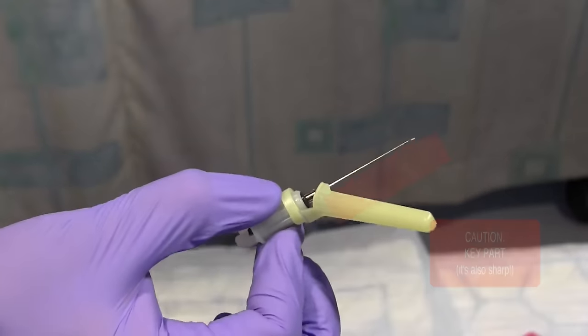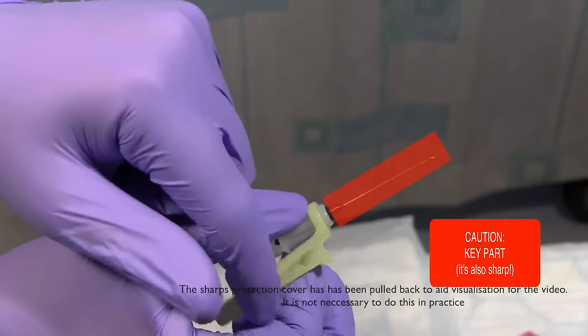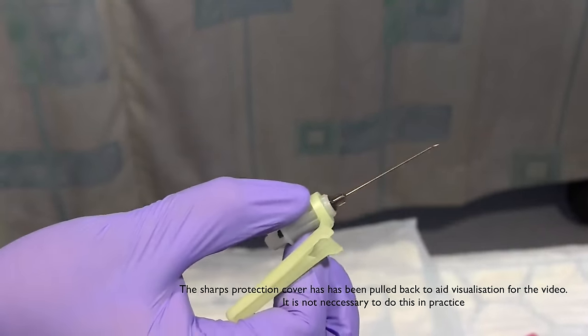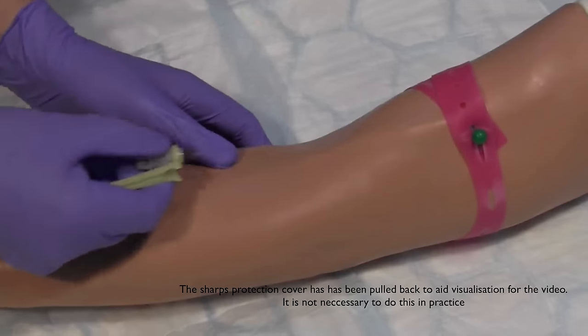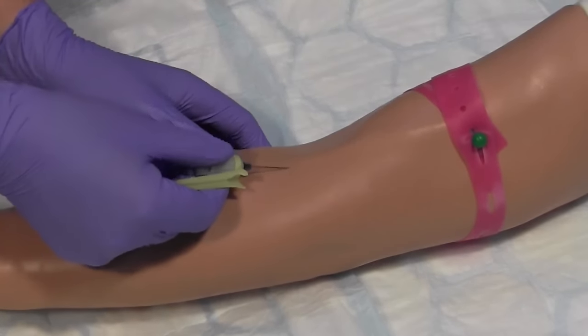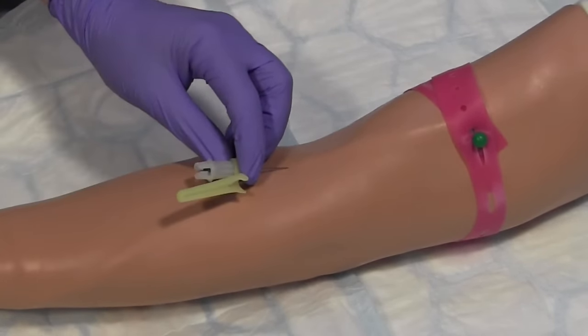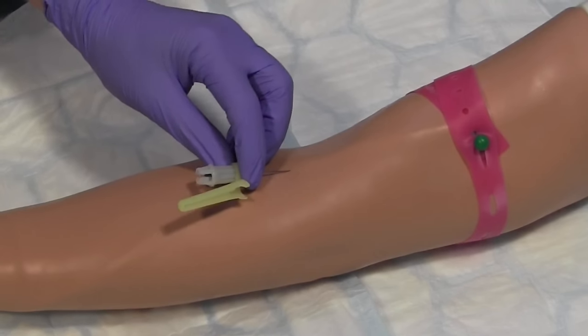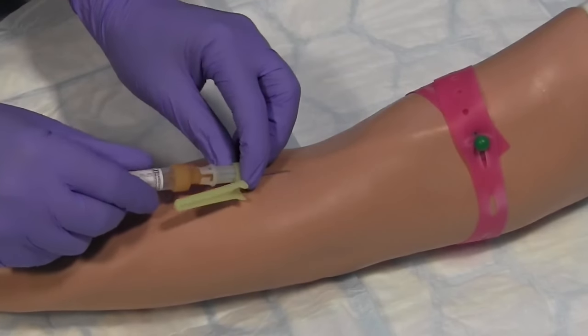During this time remove the protective cover from the needle. Remember you've exposed a key part. Tethering the skin with your non-dominant hand will help stop the vein from moving around. Then place the needle tip at the proposed puncture site at an angle of around 30 degrees to the skin with the bevel facing upwards. Warn the patient. Then advance the needle so that it pierces the skin and enters the vein. With some systems you'll see a flashback of blood to show that you're in the vein. Hold the needle steady as movement will cause pain.